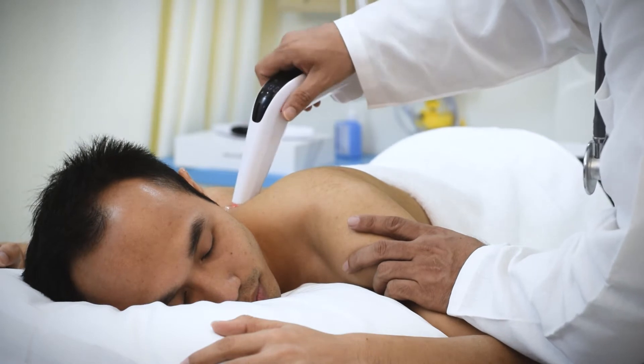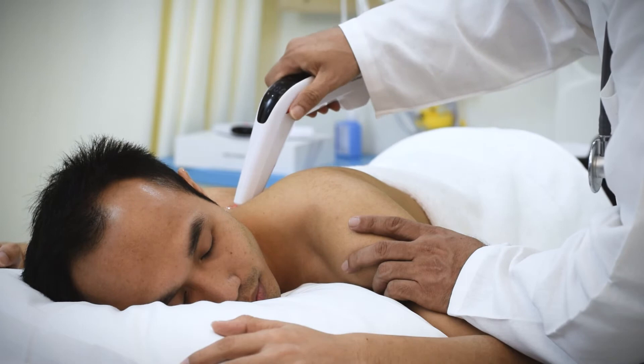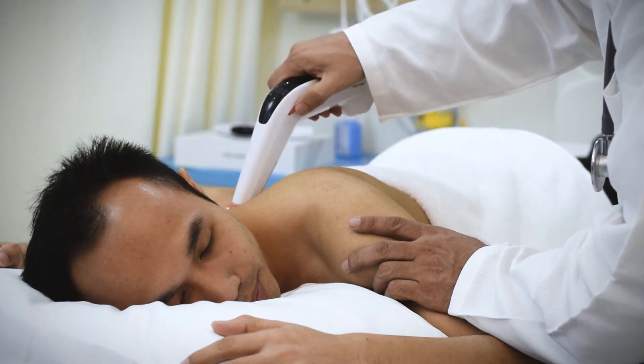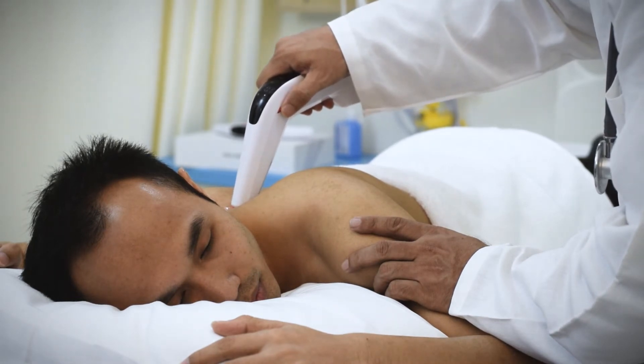Hold Cura Laser as demonstrated. Place the small therapeutic head in contact with the skin and slowly rotate the 360-degree wheel to activate the GT photonic cold laser and nanomolecular biostimulation.